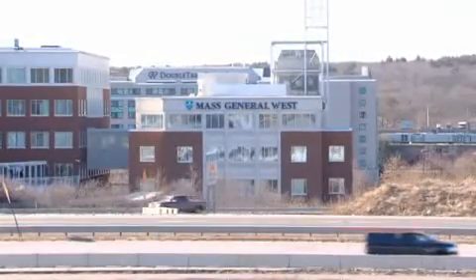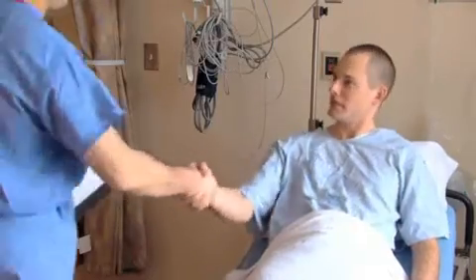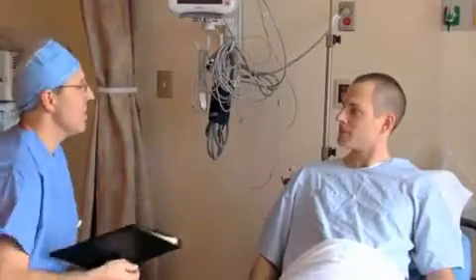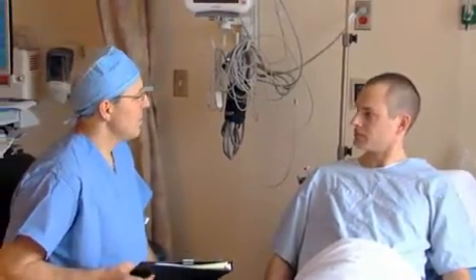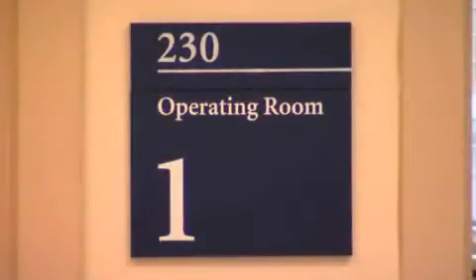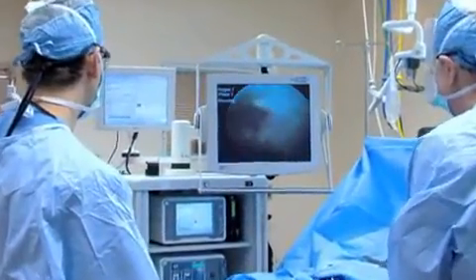Now let's look at what you will do on the day of arthroscopy. In the preoperative area, an anesthesiologist will take your medical history. The anesthesiologist will explain to you the benefits as well as the risks and potential complications of the different types of anesthesia. You will then be taken into the operating room. During the procedure, the arthroscope is put into the joint through a small incision.